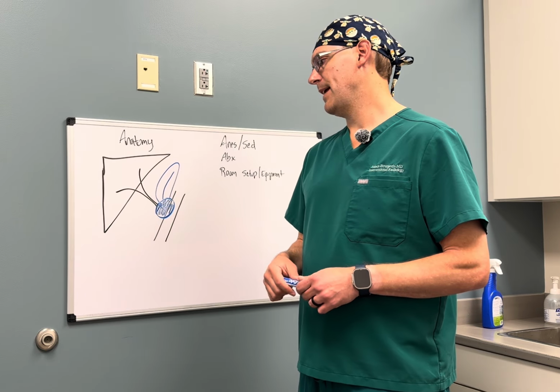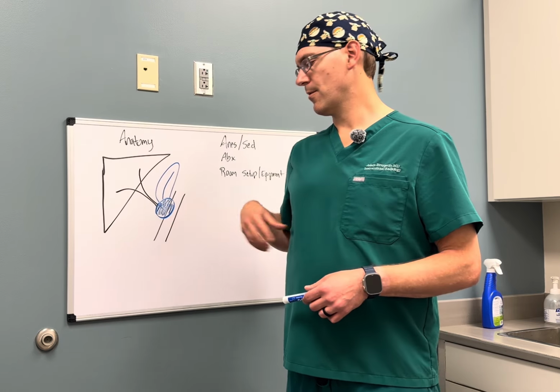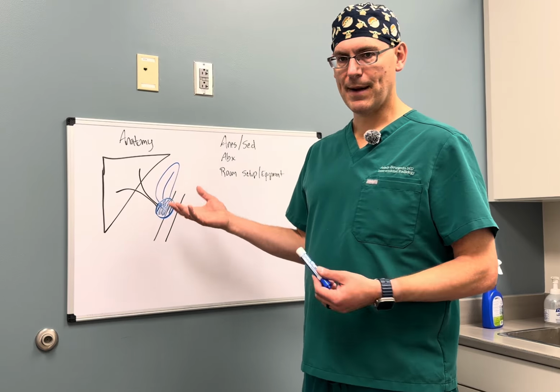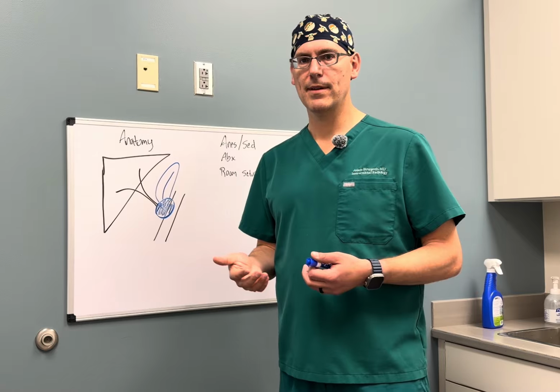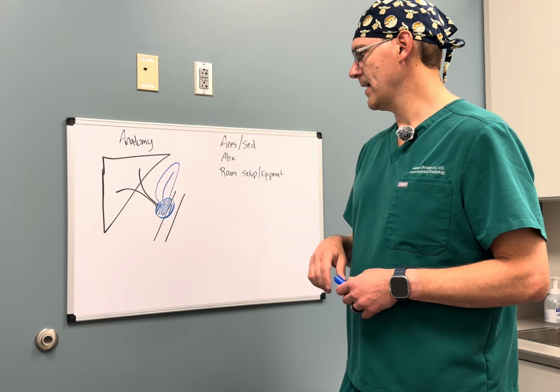And so many, if not most of the time, in this situation we're looking at a short-term right-sided drain that stays in for a few days after we stent and biopsy. So, distal common duct obstruction, single drain, we do a lot at one time, and so we tend to put these patients to sleep under general anesthesia.